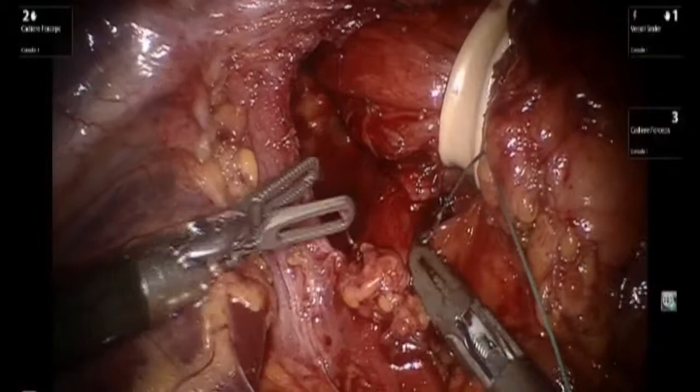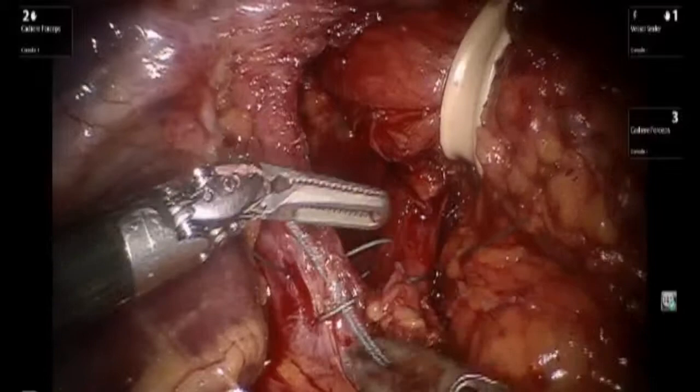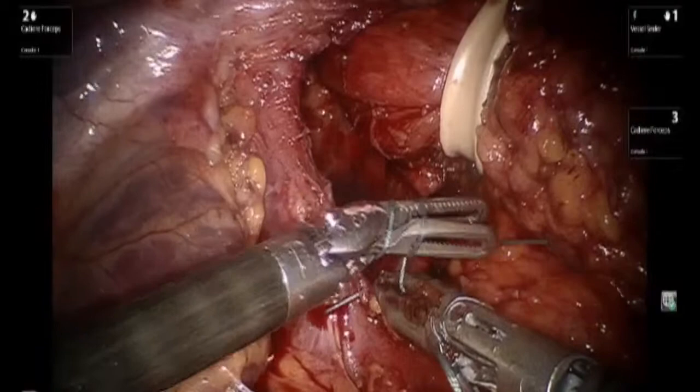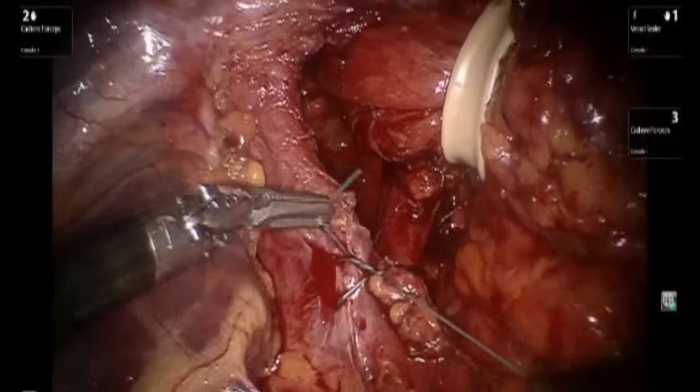We now proceed in closing the posterior crural defect. It should be noted that great care is taken in order to preserve the peritoneum overlying both of the crura, for this will provide for a much better repair. Multiple figure-of-eight sutures are placed utilizing zero Ethibond.